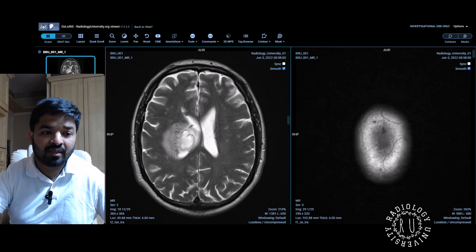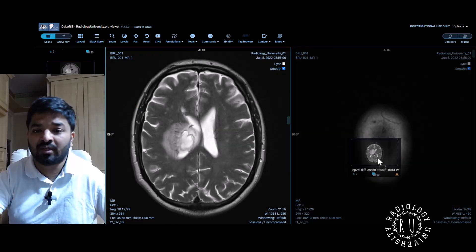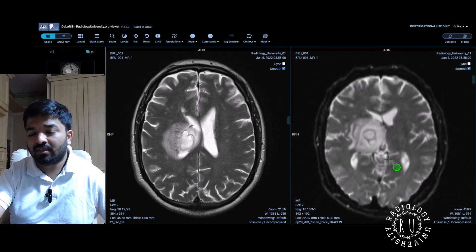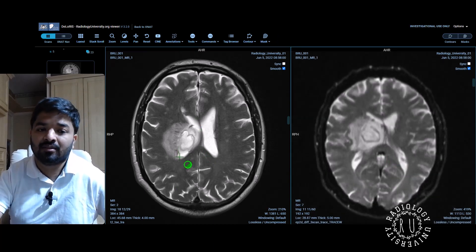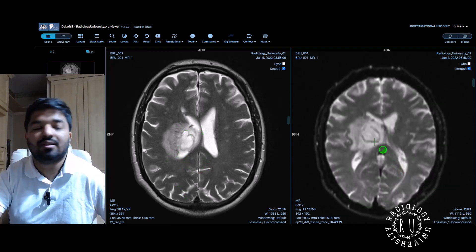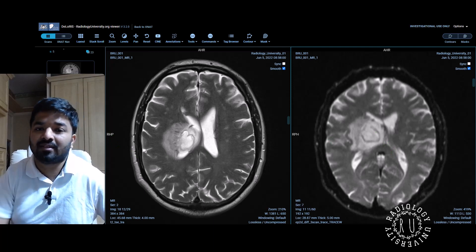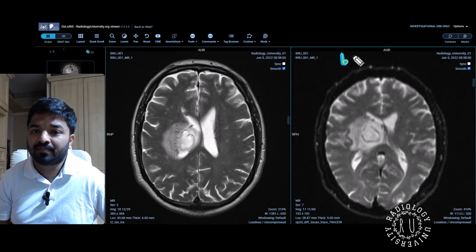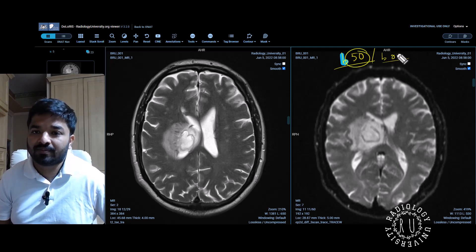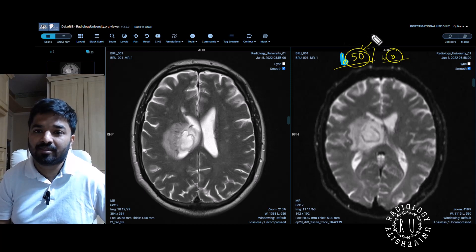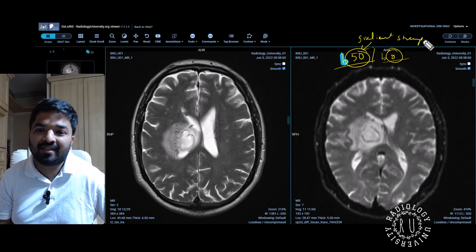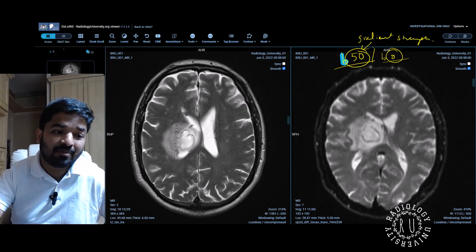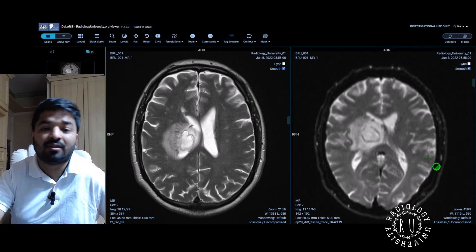I will make a layout so you can see diffusion and T2 side by side. You might say they look very similar to each other — that's because this is a b50 or b0 image. The b value is not money; it is a gradient strength. At minimum gradient strength like b0 or b50, the diffusion image will look like a T2 image. I like to call the b0 image a proxy T2.